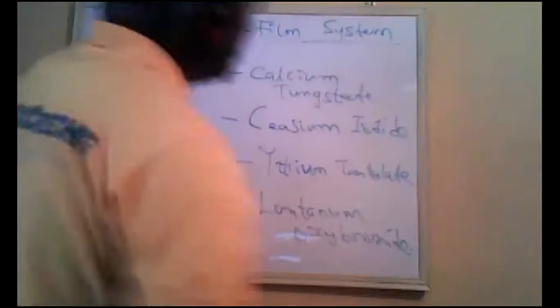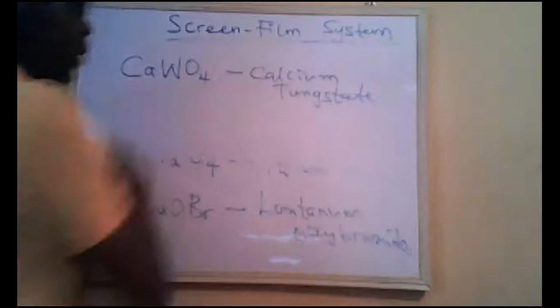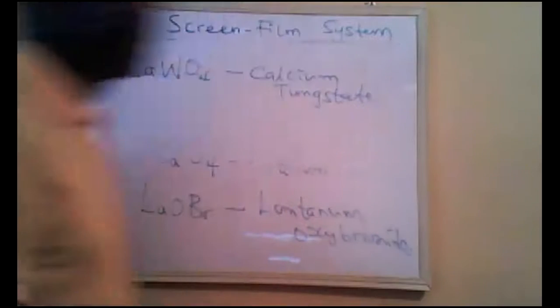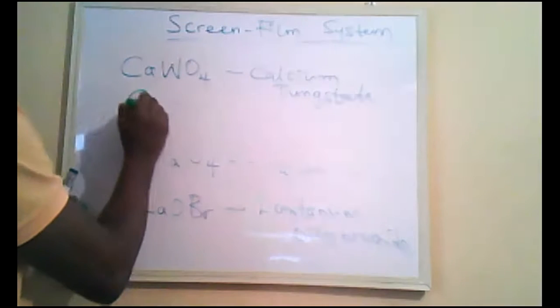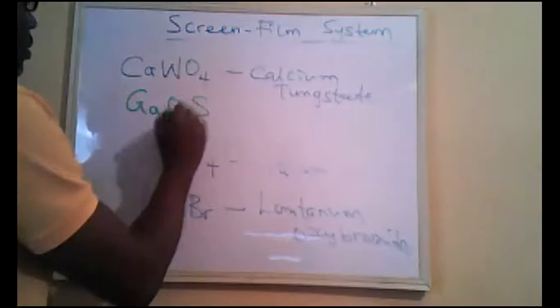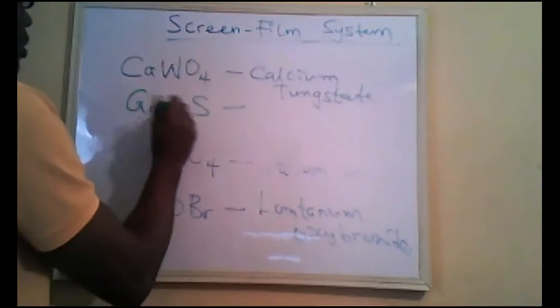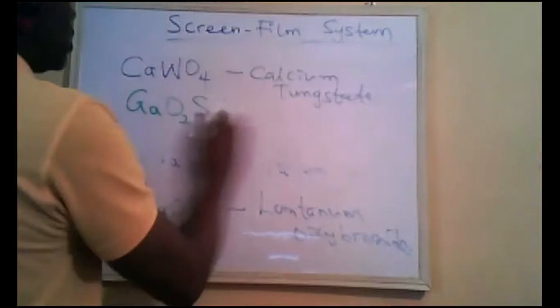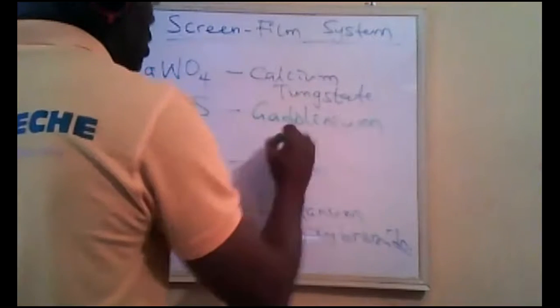Then the one we use, the most popular of them all, we're going to be comparing it side by side with calcium tungstate. Gadolinium oxysulfide.